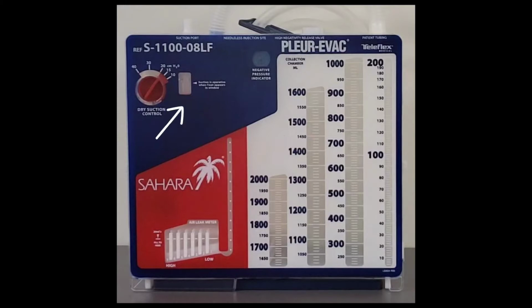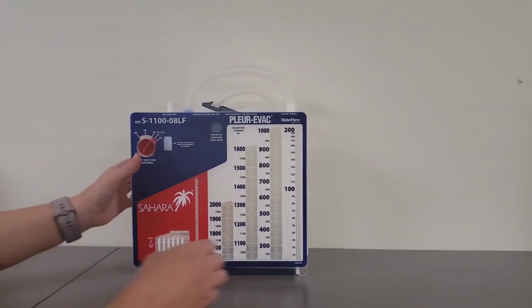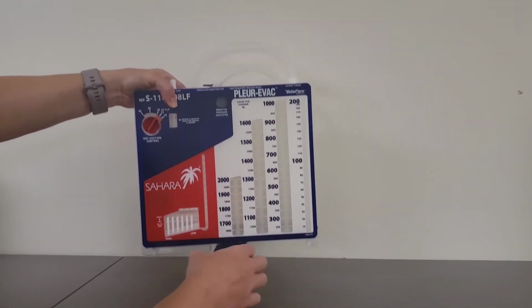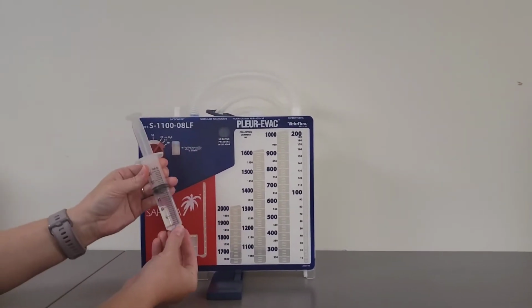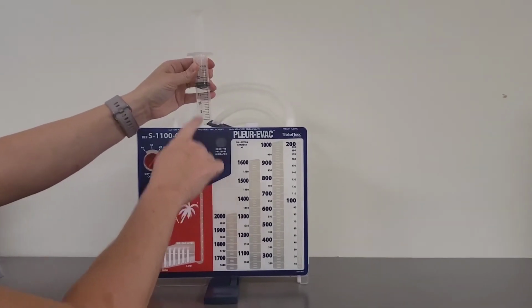Make sure your suction is working by checking here that there is a little orange ball or cap floating in this window. To set up a new drainage system, remove from the package. Set up the stand and swivel the foot outward to make a wider foot base. To set up the air leak meter, remove the 20 cc syringe from the back of the drainage system. Instill the saline into the needleless injector port.